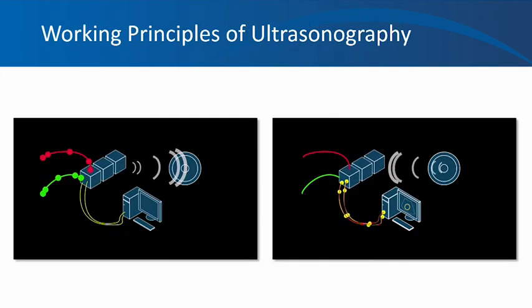The basic principle of ultrasonography is the piezoelectric effect. The word piezoelectricity means generating electricity by applying pressure, or conversion of mechanical energy into electrical energy. The opposite is called the reverse piezoelectric effect. The crystals in the ultrasound transducer exhibit both these properties.